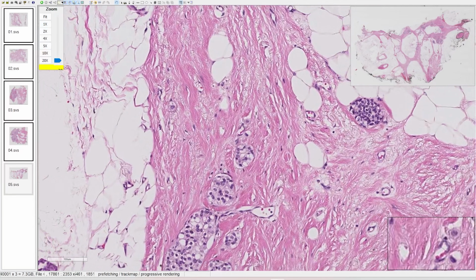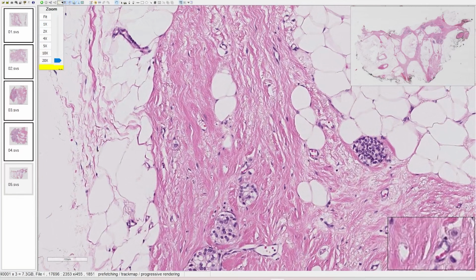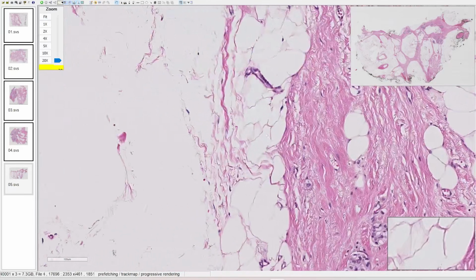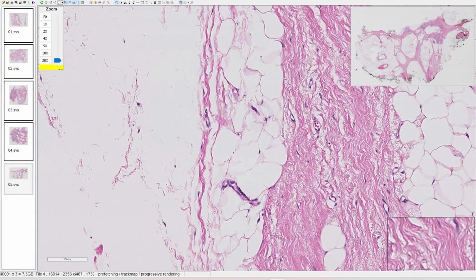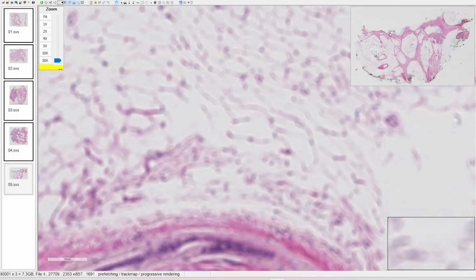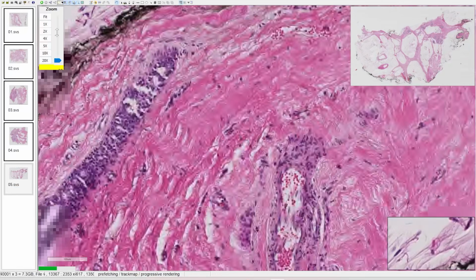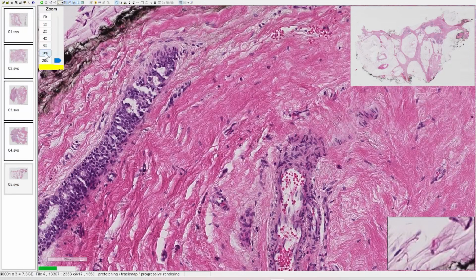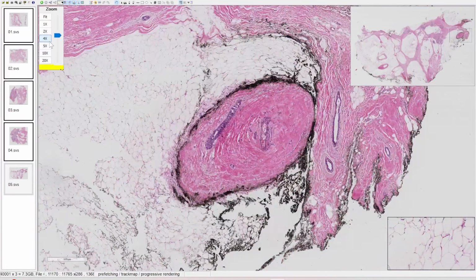And by dragging the region or the whole slide image using the left click of your mouse, you can navigate and scroll to any of the regions. Also, you have a small screen here with a thumbnail of the whole slide image. You can press on any region and you can easily navigate to it. For example, if you click here, you will navigate to that region, and you can simply, without any scrolling using the scroll wheel, navigate to 10x or 4x and so on.